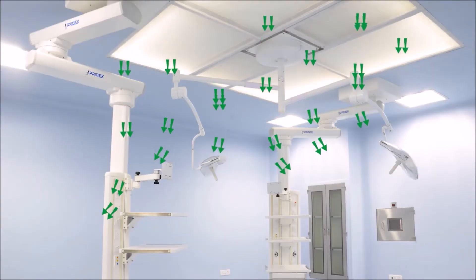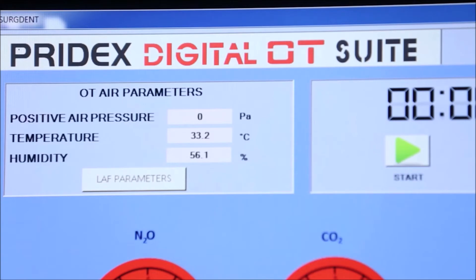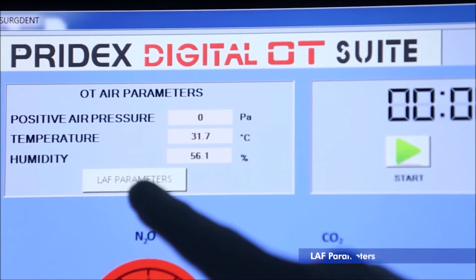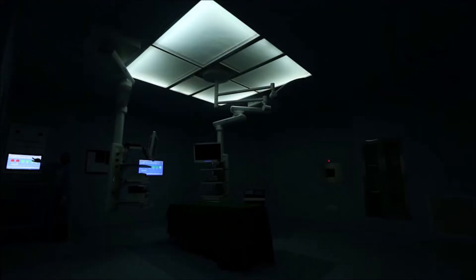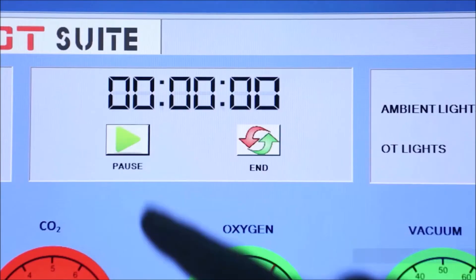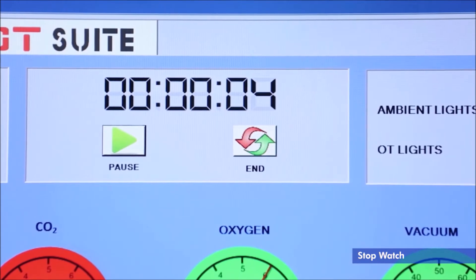Pridex OT control station. Pridex is the only company that can offer PC-based comprehensive OT control panel with OT integration. Control panel can display positive air pressure, temperature control and humidity display, LAF parameter, six gas alarms, ambient and OT light control. Stopwatch is provided to measure actual surgery time which is recorded in patient data management, light music control.